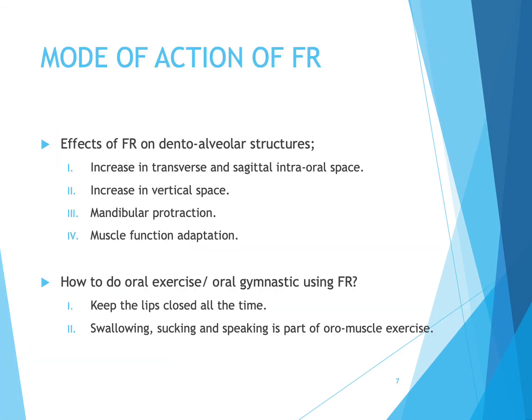So what is the mode of action of Frankel appliance? The following are the effects of the Frankel appliance on the dental-alveolar structures. First, it will increase in transverse and sagittal intraoral space. Secondly, it will increase in vertical space. Thirdly, mandibular protraction. And finally, the muscle function adaptation.